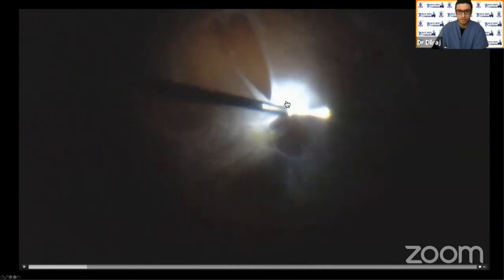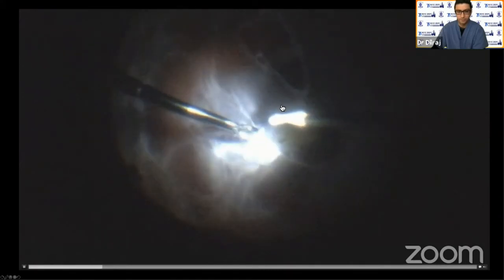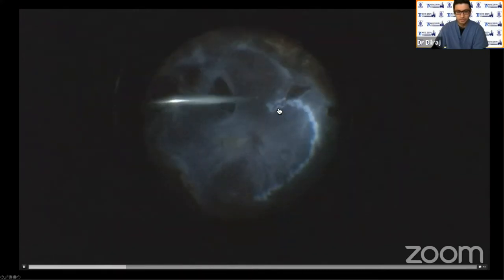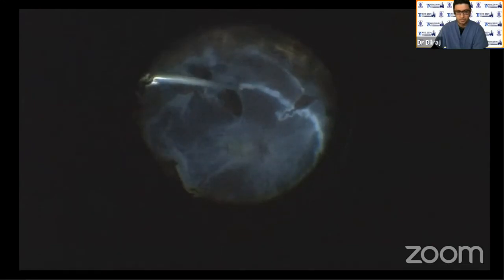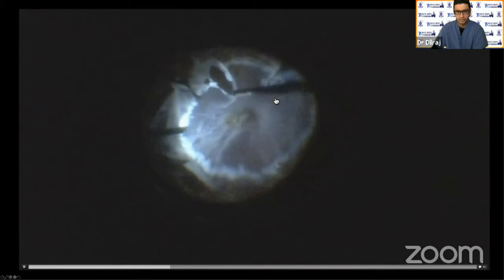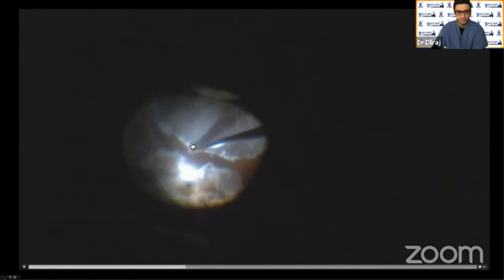Once your process of removing the membranes is complete by whatever method you adopt, including staining and use of bimanual techniques, you then make a decision about performing a retinectomy. One of the first steps I like to do is to highlight the margins of the retinectomy. You can do so by applying diathermy. You don't necessarily need to apply contiguous diathermy, but at least to the vessels that are extending across the margin.